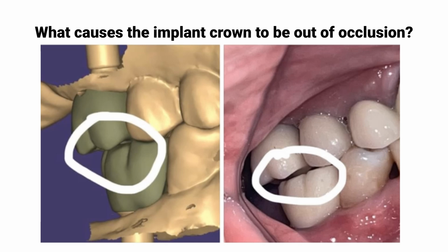Step 1. Do not tighten the scan body with too much force. In Step 2, choose a scan body with an appropriate amount of exposure.